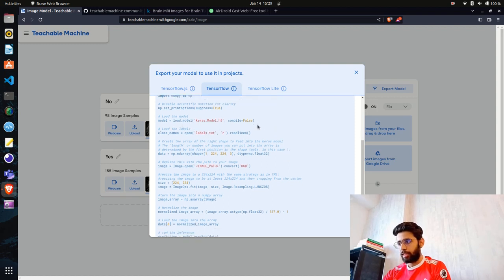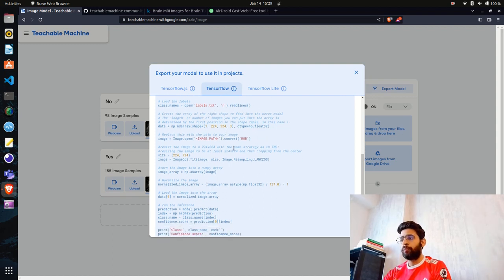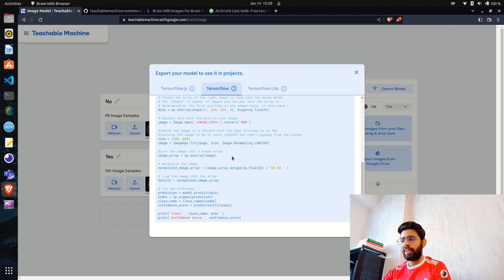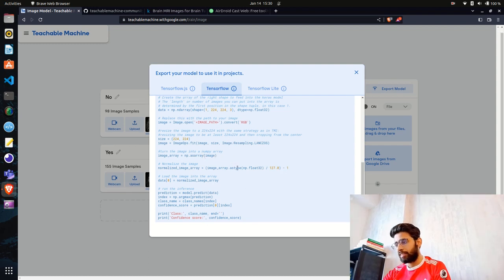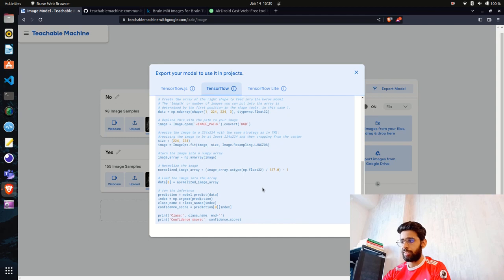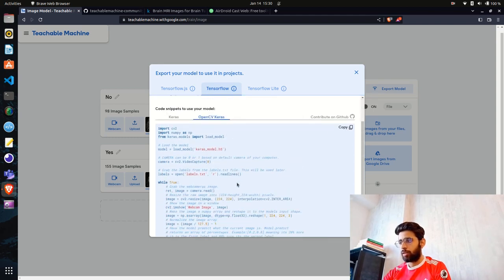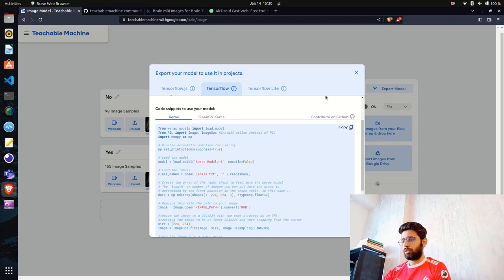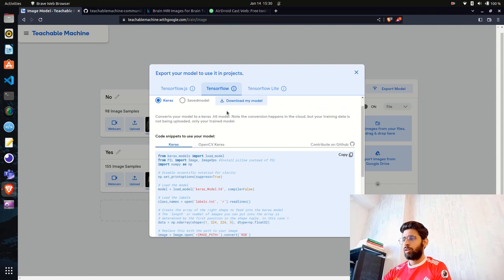The snippet shows: load the model, provide the labels from labels.txt, do preprocessing with NumPy — setting shape, loading the image, resizing, resampling, converting to array, and normalizing — then pass it to the model. Use np.argmax to find the index and predict whether the image contains a tumor or not. We'll use the Keras version of this code.